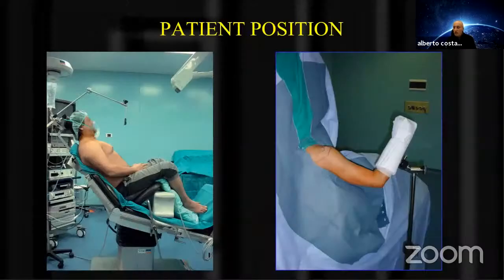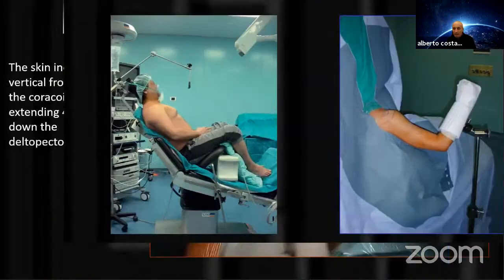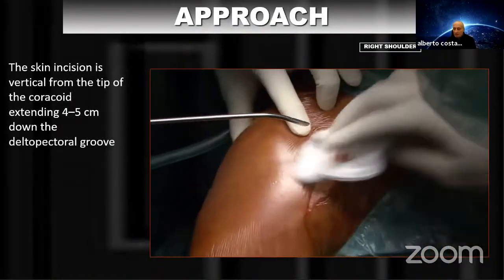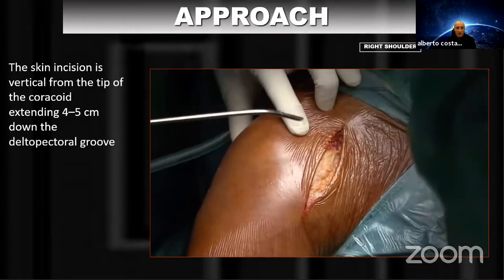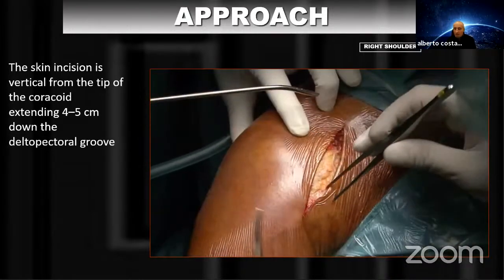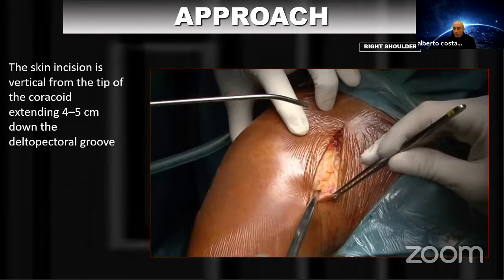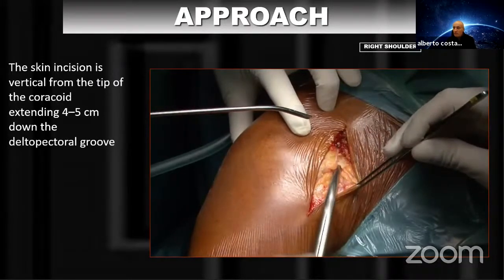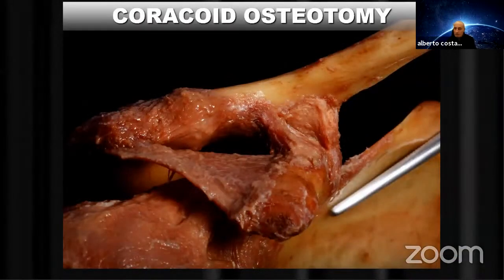This is our position. We have the beach-chair position. We are getting better with the position, but we have another seat system. We start with the incision that is the classic deltopectoral incision, 4 or 5 centimeters, and we look for the interval and for the vein. There is no major difficulty in doing this.